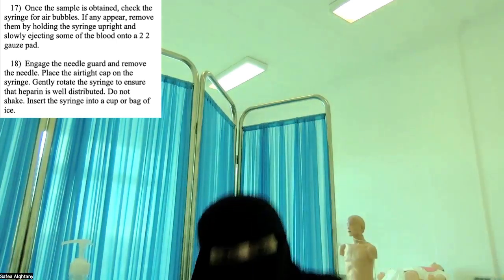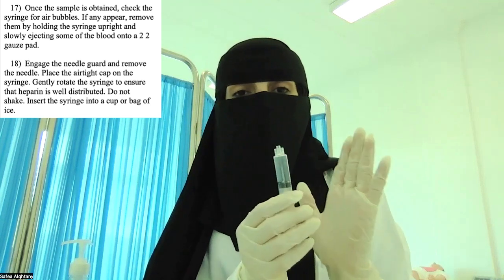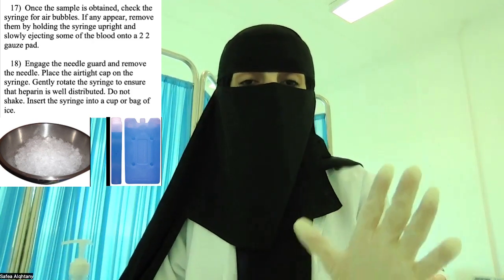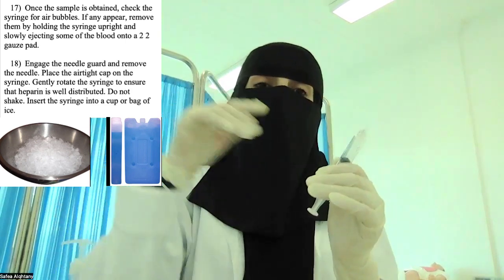I need to discard the needle and then rotate the blood inside the syringe، يعني أمشي البلد داخل السرنجة حتى يختلط كويس بالهيبارين. Attach the syringe to ice bag or cup with a crushed ice. هذه مهمة فيما يخص تحليل غازات الدم، إني لازم أضعها في ماء معاه ثلج أو ألصقها في الآيس باك، لأنه لو تركناها فترة طويلة ممكن خلايا الدم البيضاء والصفائح الدموية تبدأ تستهلك الأكسجين الموجود في العينة وبالتالي تغير لي القيم خاصة قيمة الضغط الجزيئي للأكسجين or PaO2. أوكي، فمهم إني أضعها في ثلج، موية فيها ثلج أو الآيس باك اللي ممكن نثبت عليها السرنجة.